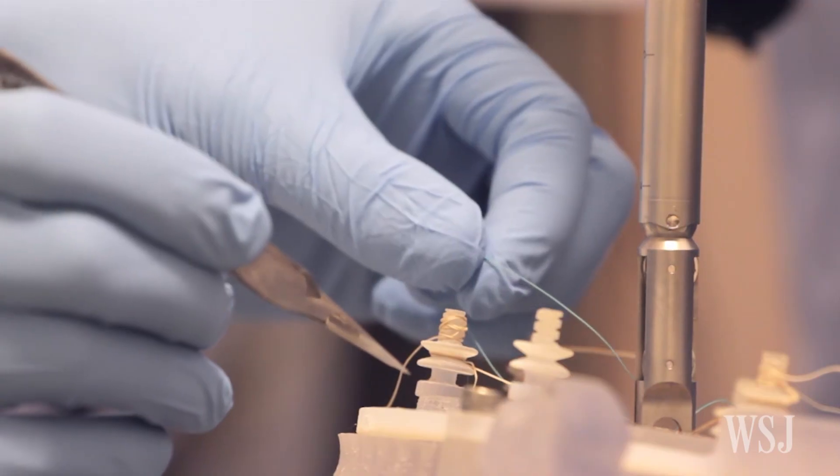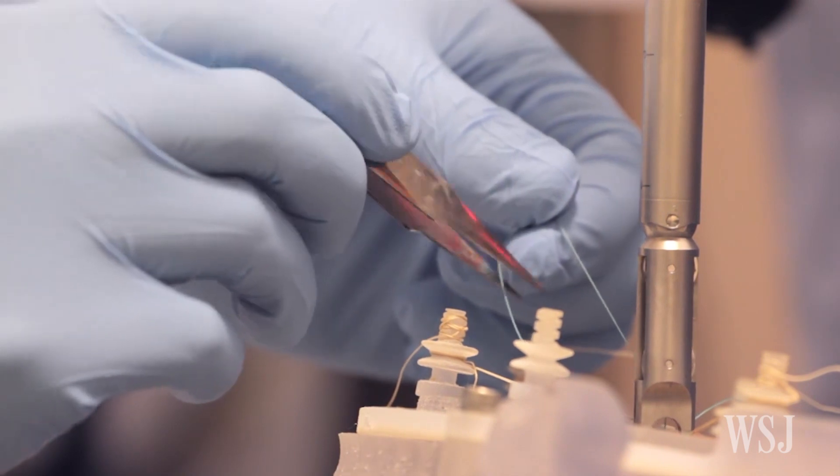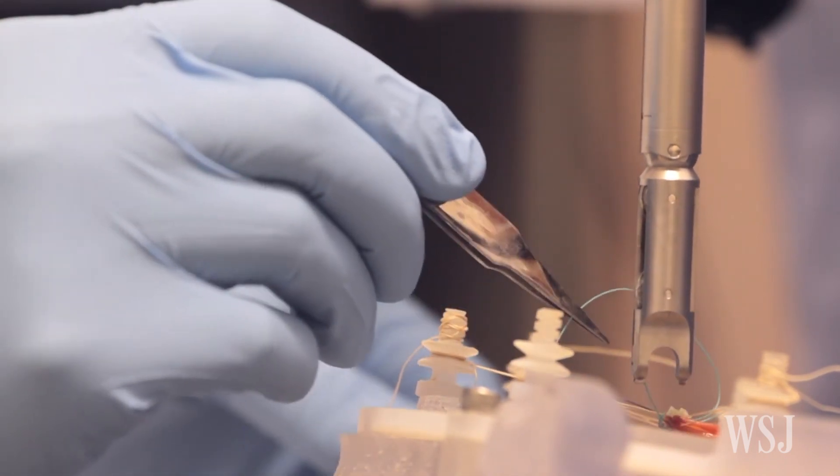We programmed in what is the ideal spacing between sutures, what's the perfect tension for each suture.